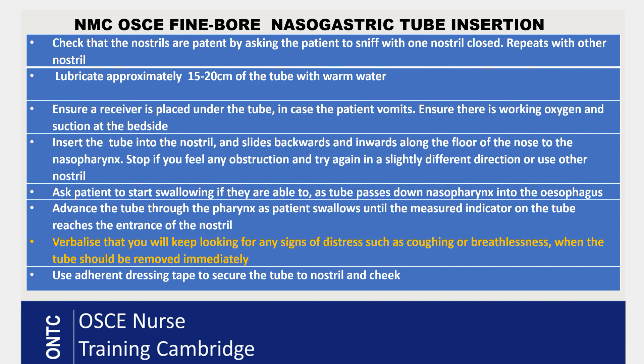Lubricate approximately 15 to 20 centimeters of the tube in the warm water. Before inserting the NG, make sure you have a kidney dish or vomit bowl placed under the patient's mouth and nose. Also verbalize that you will ensure there is working oxygen and suction at the bedside, in case the patient develops any difficulty breathing.